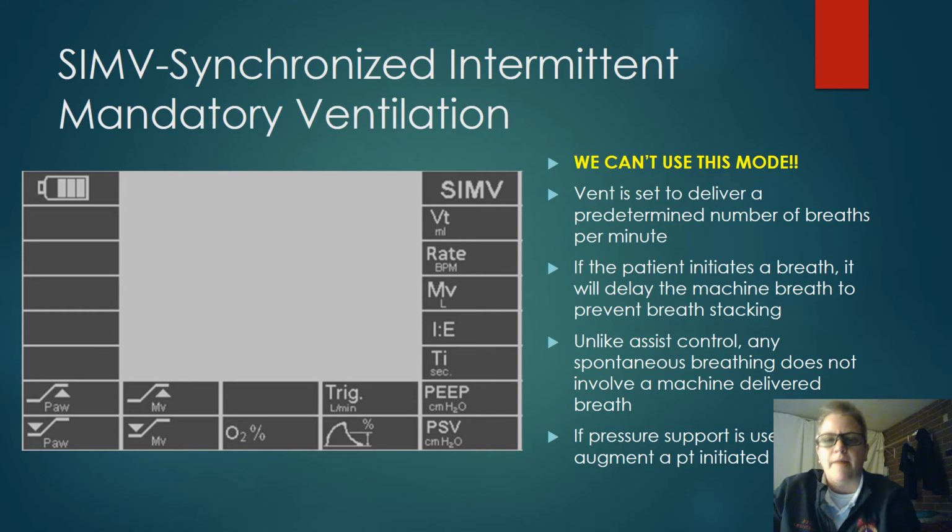Okay, let's talk about SIMV. Now, according to the EMS Physician Commission, we cannot use SIMV, not a regular paramedic. A critical care paramedic can. So if you're working for somebody that has their critical care paramedic license, that they do those critical care things, then you can use this synchronized intermittent mandatory ventilation.